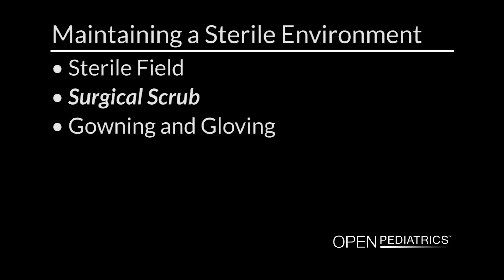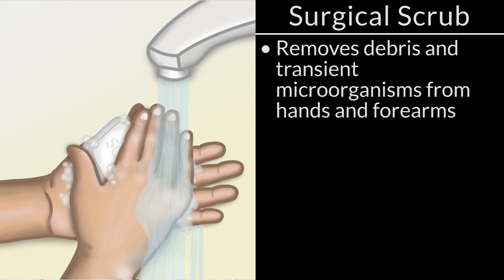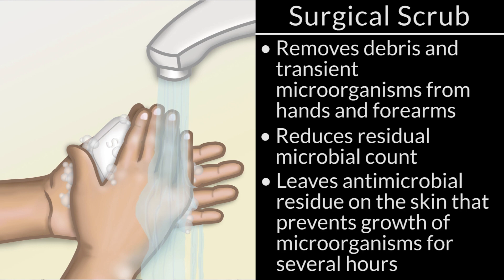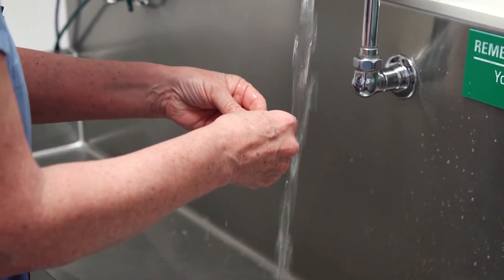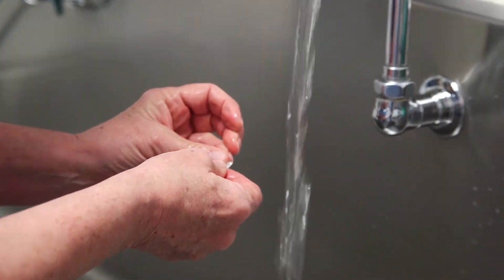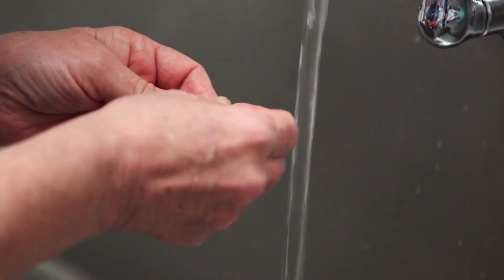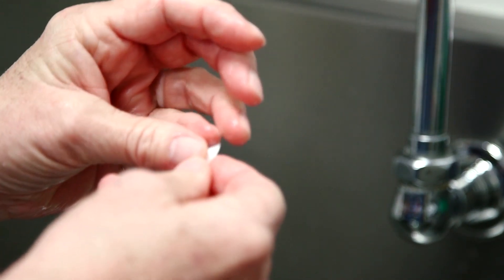Surgical Scrub. The surgical scrub is a process of removing debris and transient microorganisms from the hands and forearm, reducing the residual microbial count, and leaving an antimicrobial residue on the skin that will prevent growth of microorganisms for several hours. If this is the first scrub of the day, a three-minute scrub should be performed. As demonstrated here, the use of an antiseptic and water is utilized. A nail cleaner is first used to remove dirt and debris from underneath the nail bed.